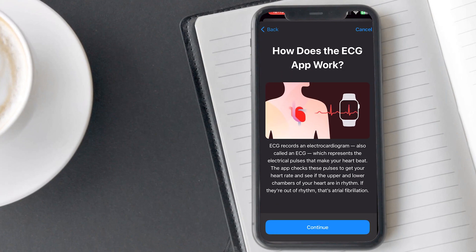On this screen, Apple explains how the ECG app works. The ECG records an electrocardiogram which records the electrical pulses generated by a heart, and then checks whether the lower and upper chambers are working in rhythm or not. If they are out of rhythm, it is called atrial fibrillation.